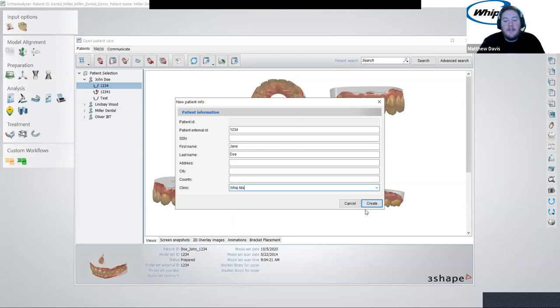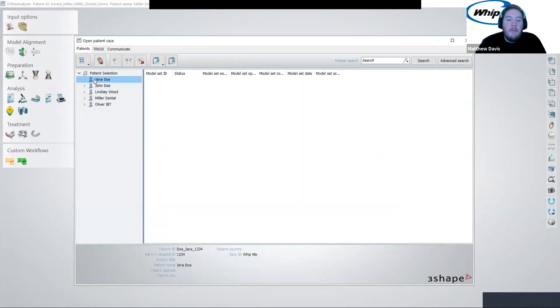I like this about the Ortho System software compared to Dental System. In Dental System, you start at the order form and then you prescribe what every move after that is going to be. With Ortho System, you're not tethered to that exact workflow. You can create a case, import scans, and then you have different workflows you can jump in and out of without restrictions. Once you've filled out all the information you'd like, hit create. Now we have the patient, but we don't have any models to work with — so we click 'new model set.'